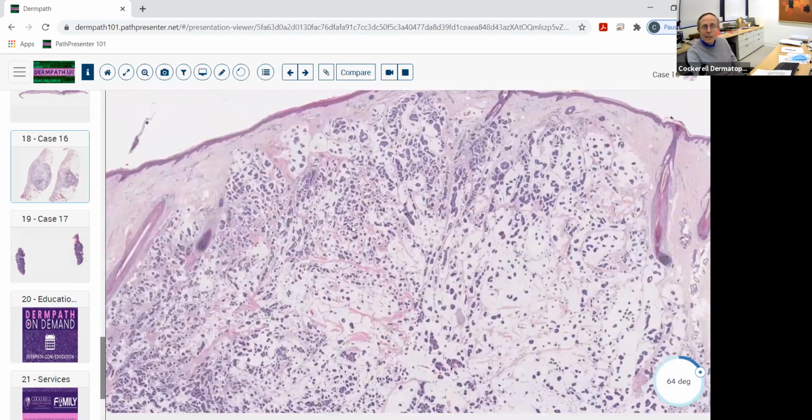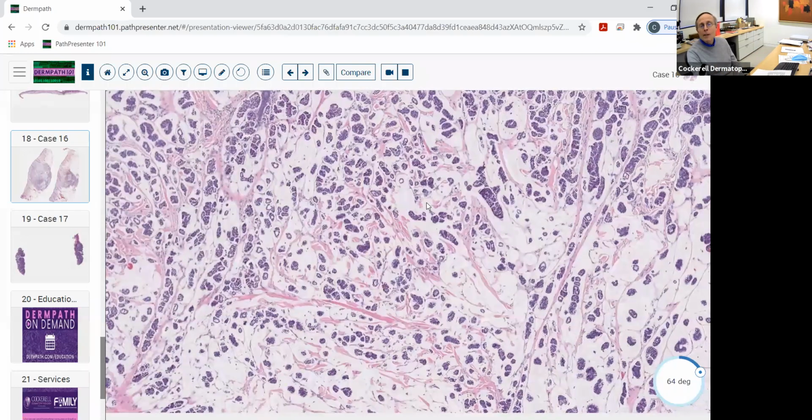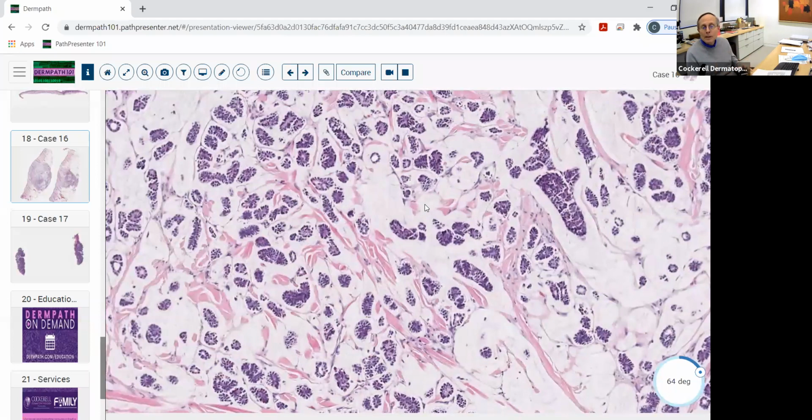Now, there's one other lesion that's relatively newly described that can also give you abundant mucin, and it's mucin-producing neuroendocrine eccrine carcinoma. This is a mucin-producing eccrine sweat gland carcinoma that's got this neuroendocrine differentiation. And to me, that's just basically a variant of this mucinous carcinoma of eccrine sweat glands that somebody decided a few years ago to start working up, and they did stains for neuroendocrine markers, and boom, they found that there's some positive staining with INSM1 and with synaptophysin and whatnot.